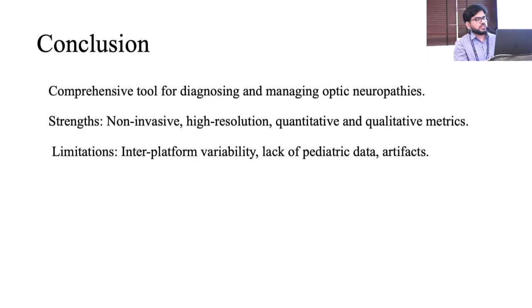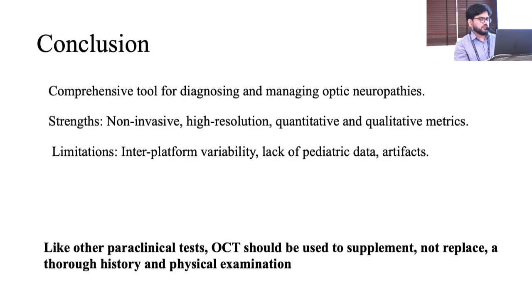So in conclusion, it's a comprehensive tool for diagnosing and managing optic neuropathy. It has strengths and limitations, but the most important thing is, like any other paraclinical test, OCT should be used to supplement, not replace, a thorough history and physical examination. Thank you.